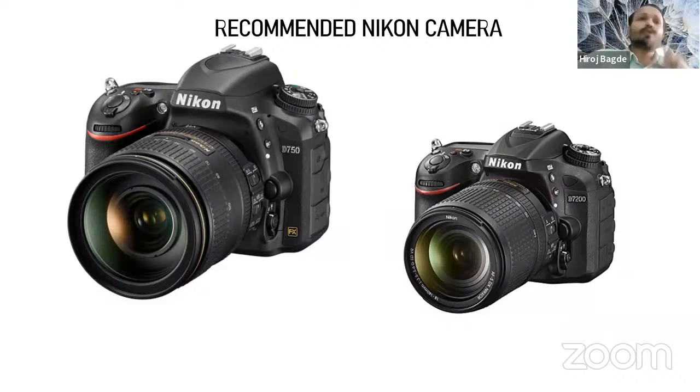It is very good to buy a Nikon D7200, anything from the 7000 series, because we need to have Wi-Fi inside it. We need to have transfer of images from this to another device to show the images to the patient, over a large screen or a big screen, so that the patient also gets to know what kind of treatment is going on, as well as for us to know what kind of mistakes or rectifications are needed.